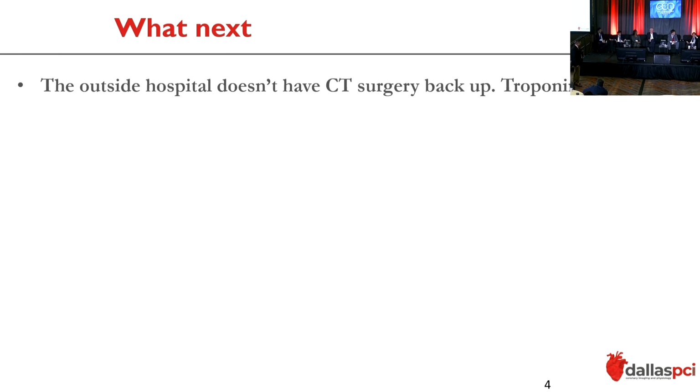I think getting a wire down that LAD and imaging it, seeing if it's thrombus and considering aspiration, or moving on with small balloons to just get your track and get the vessel opened, is going to get the patient out of that spiral quicker. Do we know anything about LV function at this point? The EF is 20 to 25%.